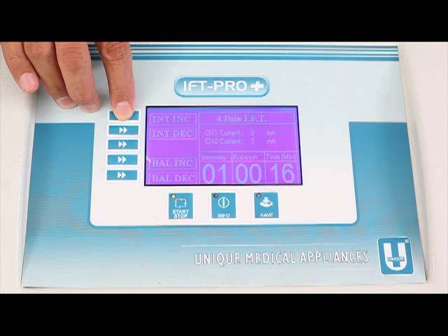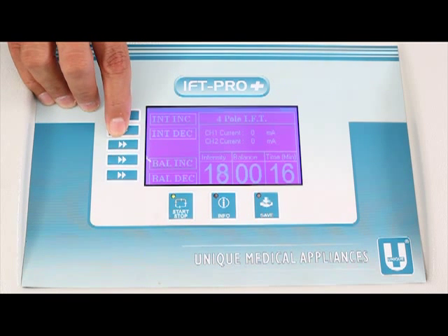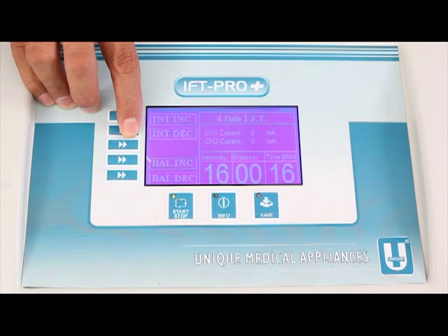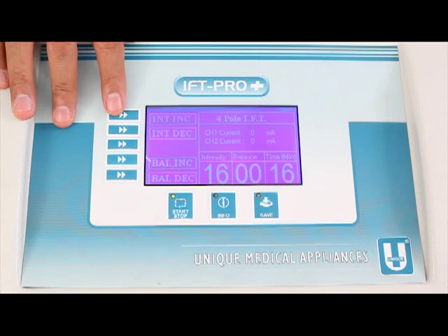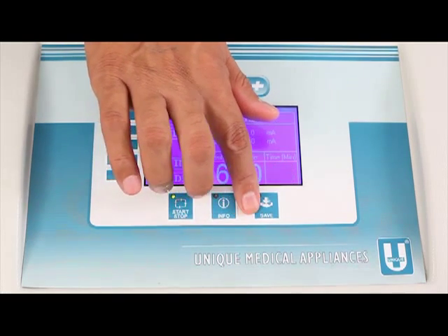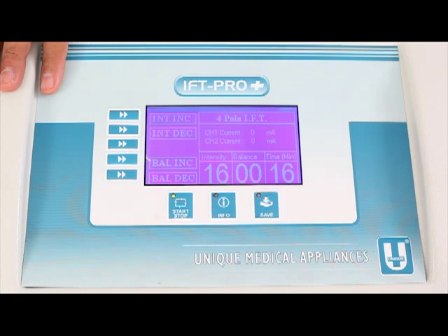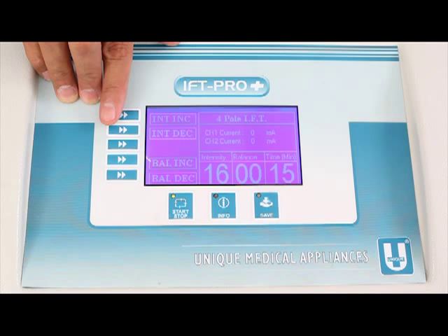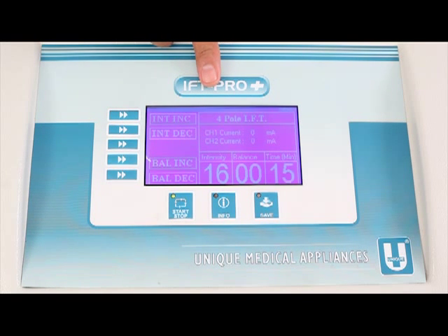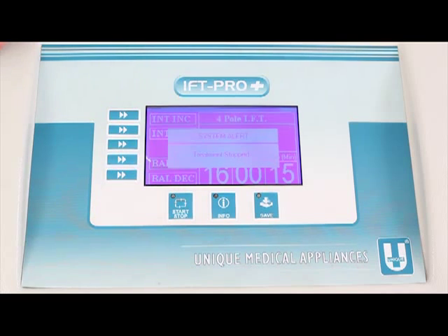Pressing F1 increases intensity: 17, then 19. If the patient finds it too harsh, press F2 to reduce it: intensity 18, then 16. When treatment is running, pressing the info switch — the center switch in the horizontal row — recaps the current status: Intensity 16, Balance zero, Time 15 minutes. To stop the treatment mid-session, press the start-stop switch again: 'Treatment stopped.'